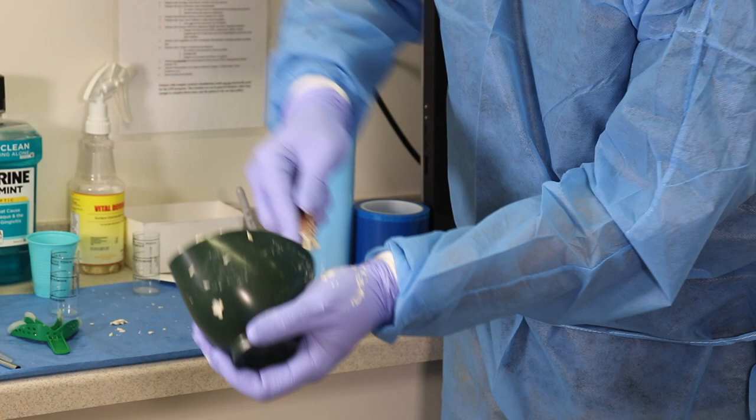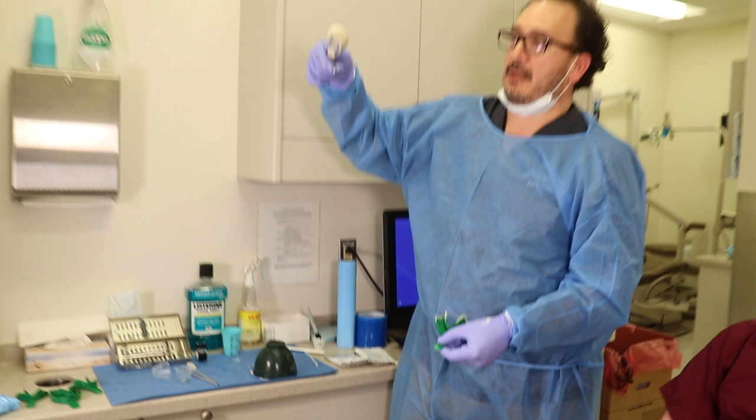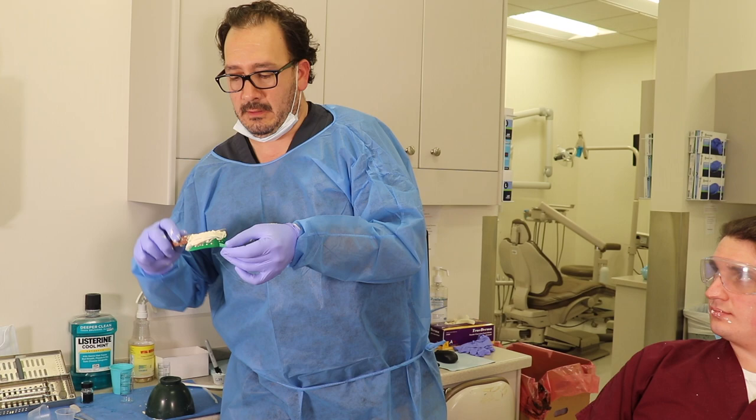Okay, working time, you will start. The more you make, the more impressions you take, the better. You see the creamy texture? The more impressions you take, the better you will get at timing, or getting that working time of the materials, okay? Remember, the temperature of the water will directly affect it.